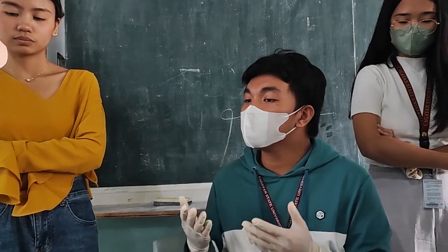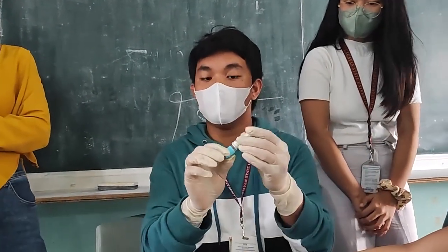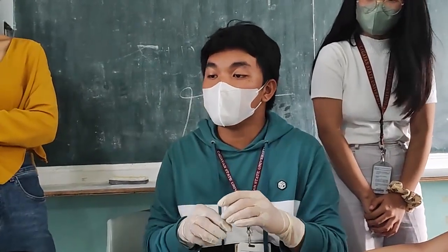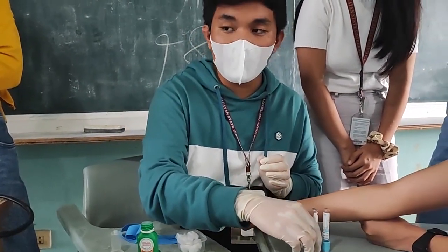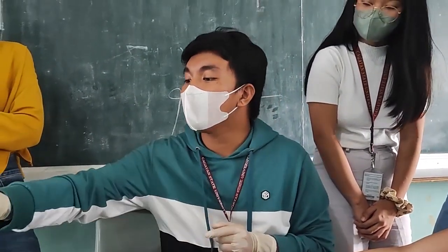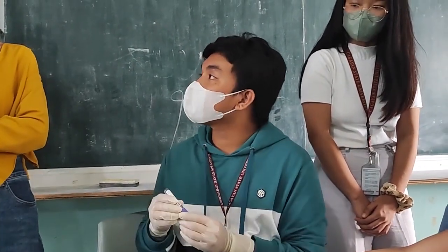So dito po sa ating scenario, sabi po dito, di ba, meron po dito yung APTT at saka yung PT. So ang first na tube po natin na gagamitin is itong blue. Ito po yung blue. And then the next one naman po is yung ating red since meron po tayo ditong sodium test. And then the last one naman po is itong ating lavender top. Kasi meron tayo ditong nire-require na test na ESR, CBC, HH, at saka platelet count po.